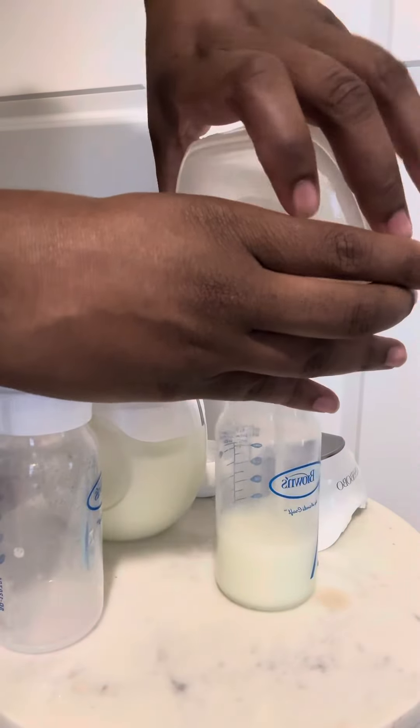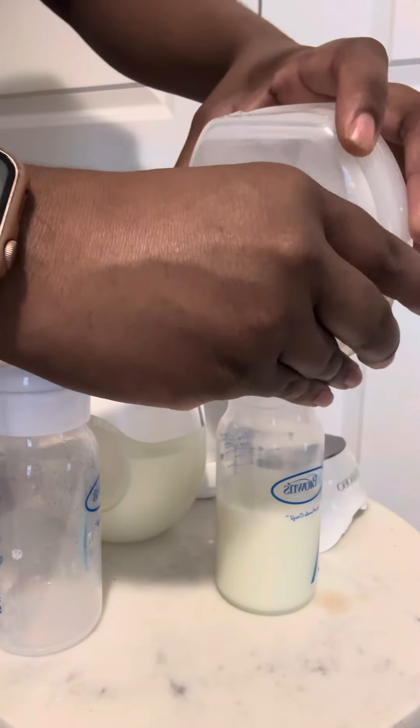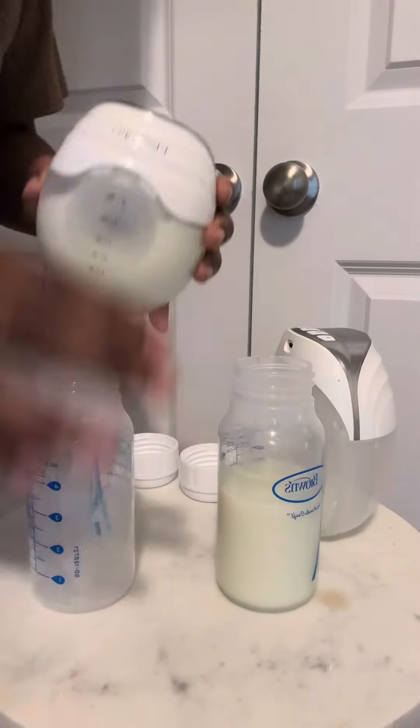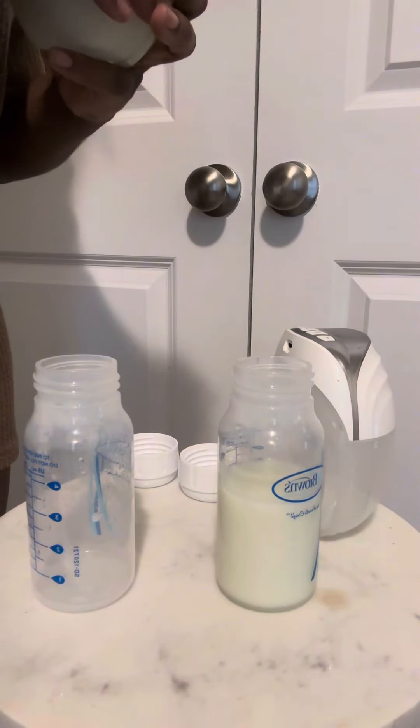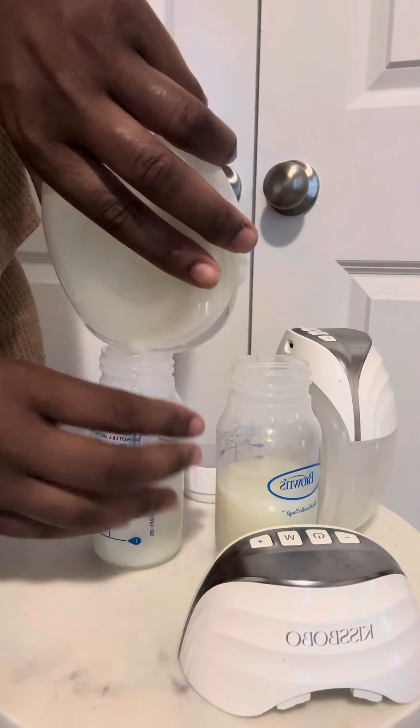One key piece of advice: sometimes you do have to push the silicone portion for the rest of the milk to come out. We need every drop, every pump — we don't have time to be leaving milk in there because the milk that's left in the pump is milk my baby cannot drink.